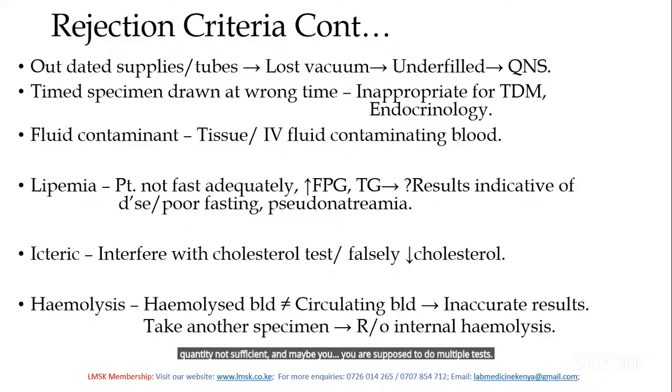Then timed specimen drawn at the wrong time. If it is drawn at the wrong time, you reject. Like in endocrinology, some hormones are time specific.